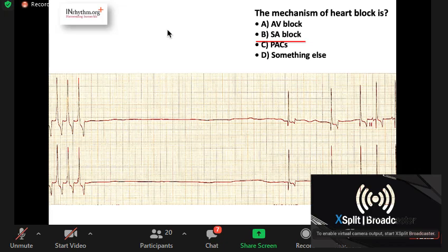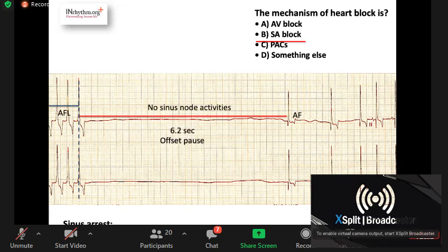He is a brilliant person. His concept about ECG is great. So, Neeraj, at the first 3 beats, what do you think? There is some atrial tachycardia. Is it a tachycardia with a regular RR or irregular RR? Seems regular, sir. It is a regular RR. So, probably it is what? It may be a flutter or an atrial tachycardia.